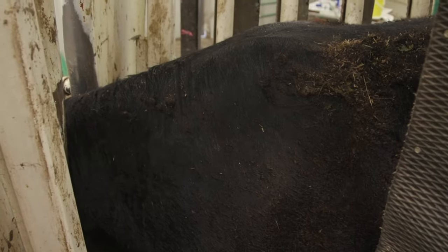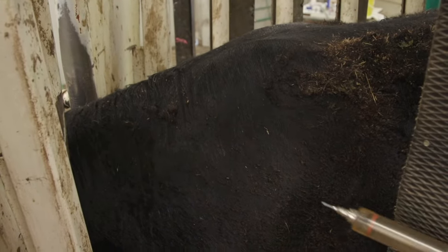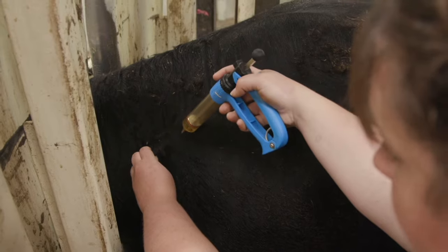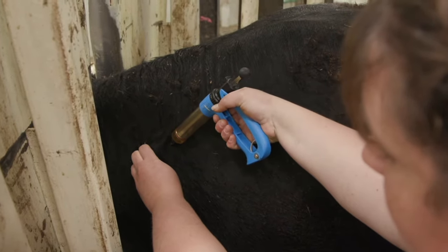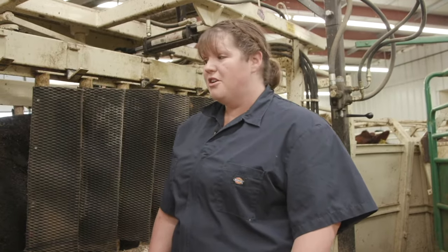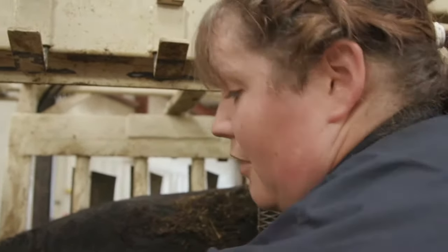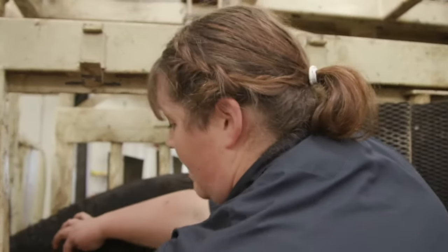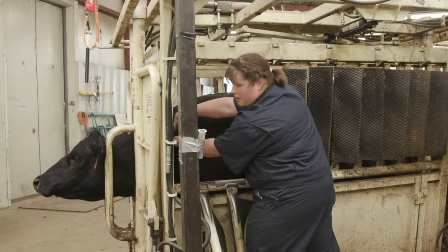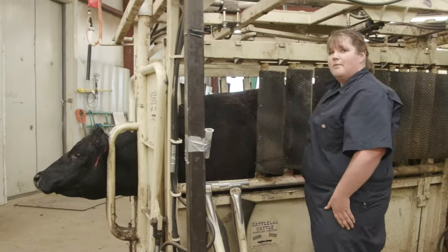A second technique is a two-handed technique where you perform a skin tent, which can sometimes make it easier to get into the subcutaneous space. If you're going to use a skin tent, you're going to pull the skin out away from the animal making a tent, come in nice and close to the body, poke in, pull your trigger, release, and pull back out. You'd go to your injection site, use one hand to pull the skin out away from the animal — it brings the skin up and out, making a bit of a tent — then place your injection close to the body, straight down into that skin tent. Give your vaccine or drug, release the skin tent, and pull your needle out.